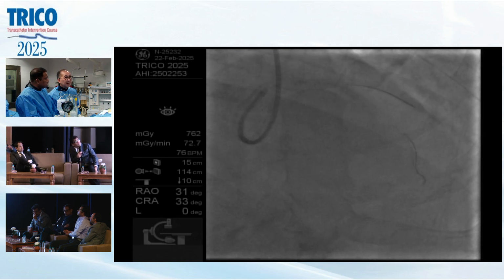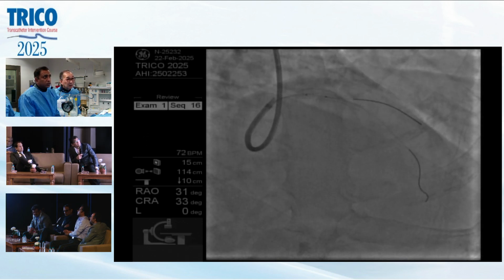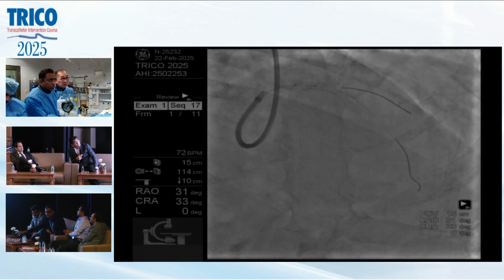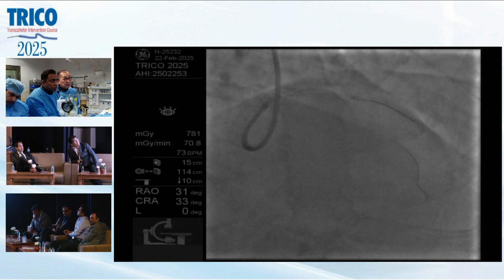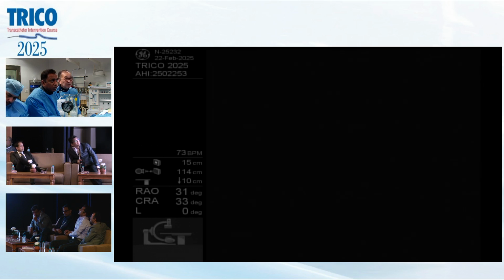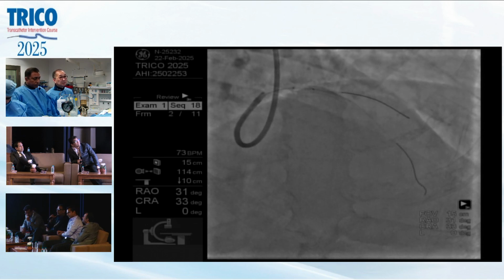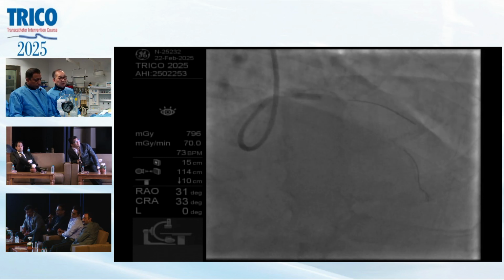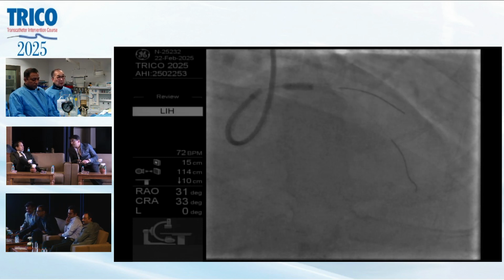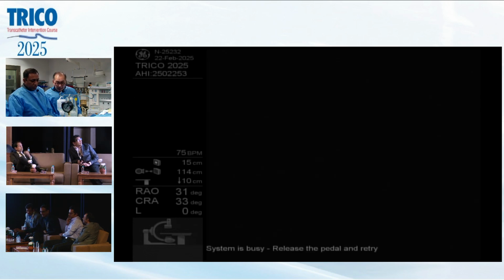Tak, is your guide a 7 French guide? It's okay, right? Yeah. Proximal, yeah. It's a little bit more. So we're using StentBoost to position the balloon, is it? And good. Does anybody have a preference as to which balloon you use depending on the shoulder of the balloon for the proximal optimization? What kind of balloon here? What brand? SMT. SMT is from where? Local?